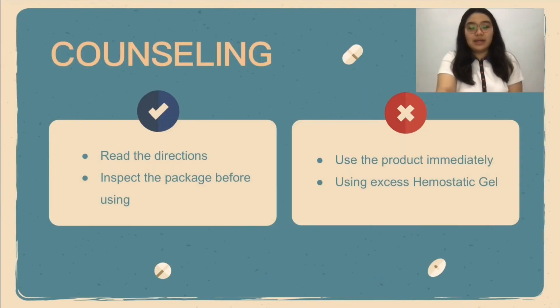We will discuss counseling in using hemostatic gel. Here are some do's and don'ts when using hemostatic gel. Let's talk about the do's. First is read the direction. Everyone knows that we should read the direction first for us to make sure to understand the direction for preparing and proper usage of the hemostatic gel.